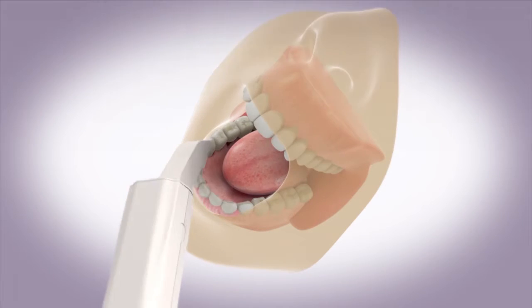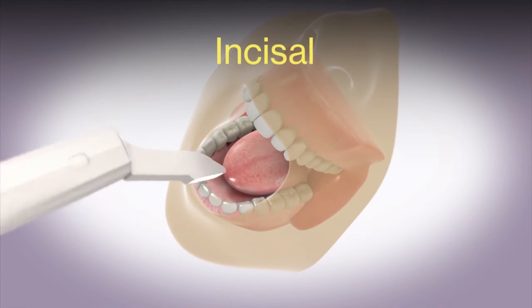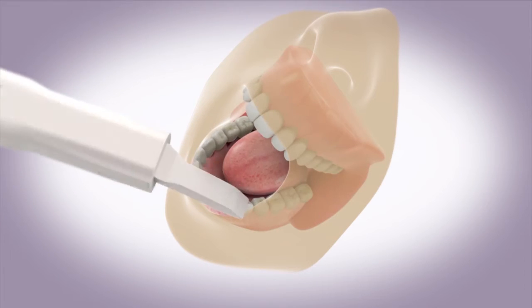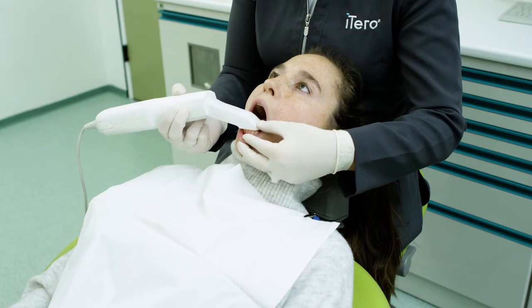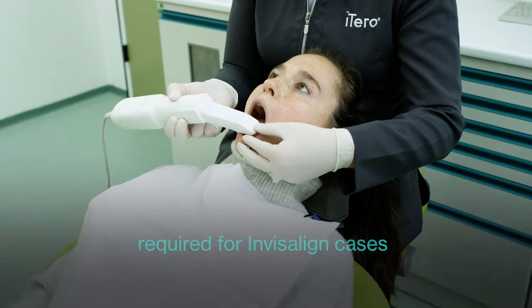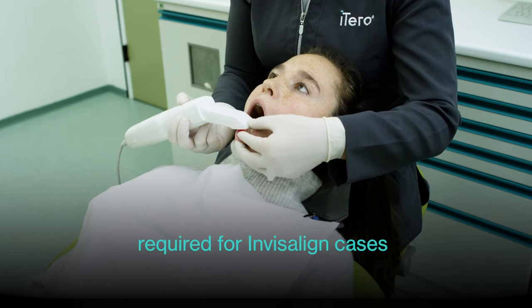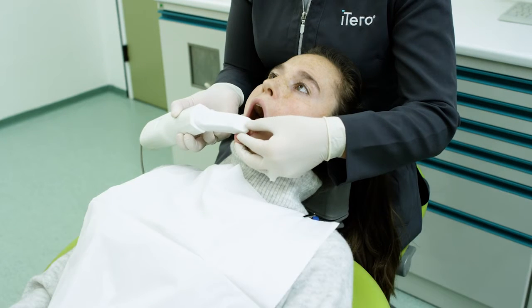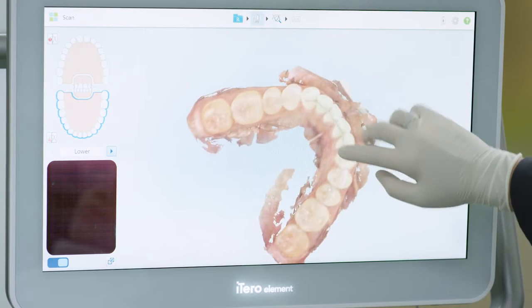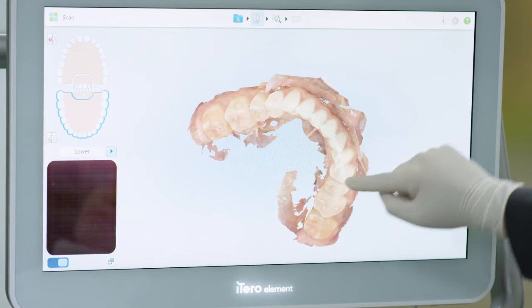After the buccal, capture the incisal anatomy of the anterior by rolling over the cuspid and lateral, or scanning across the incisal surface from cuspid to cuspid. These scans help to ensure that the lingual and buccal segments join the accurate incisal surfaces.